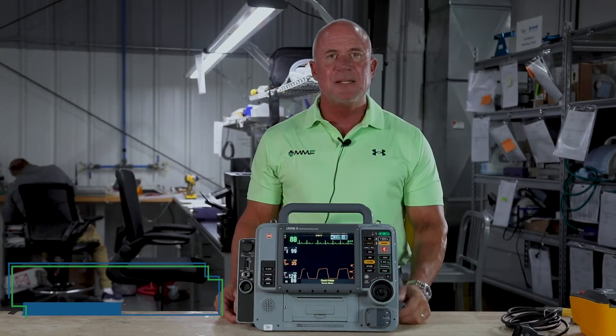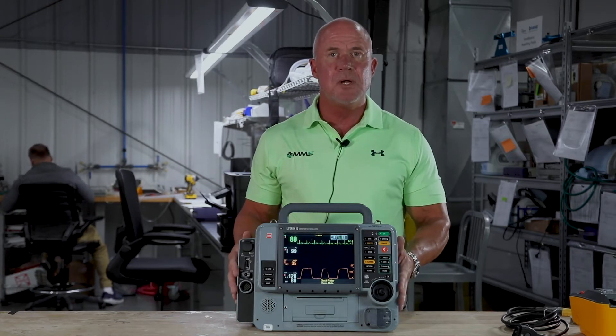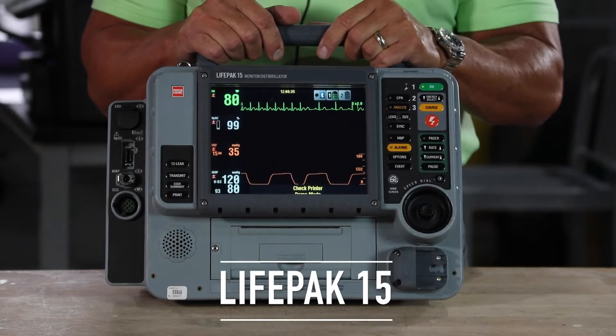Hi, this is Mitch. I'm with Master Medical Equipment, and today I'd like to talk to you about one of the options that we have available for you: a high-quality, recertified LifePak 15 monitor.